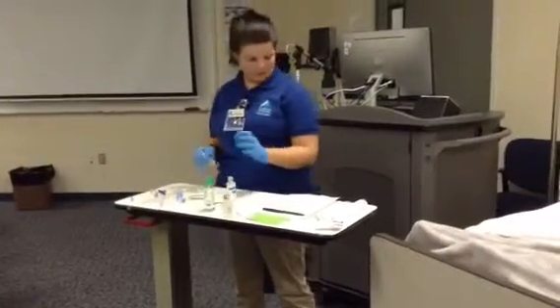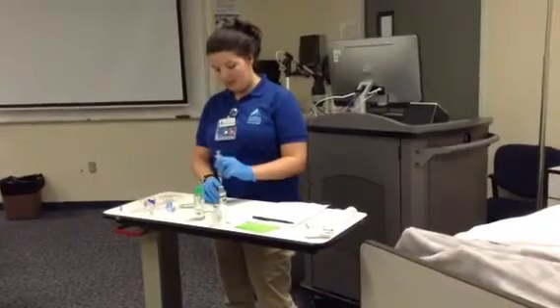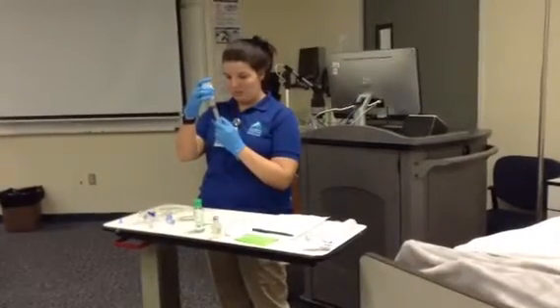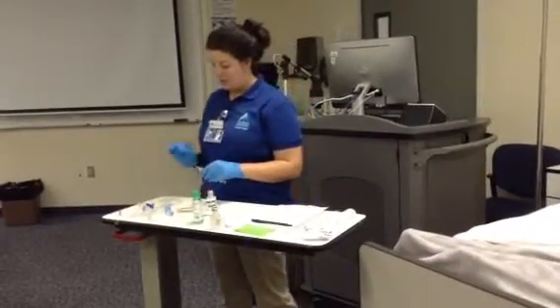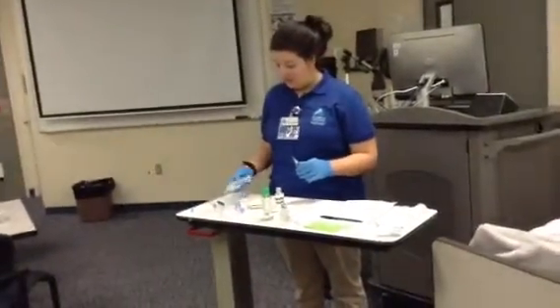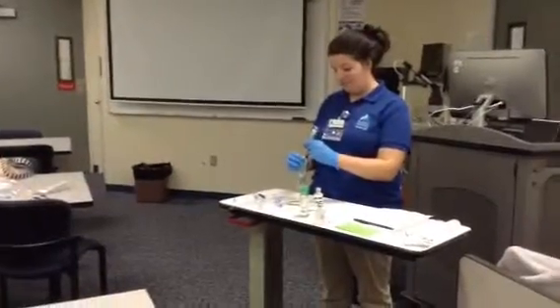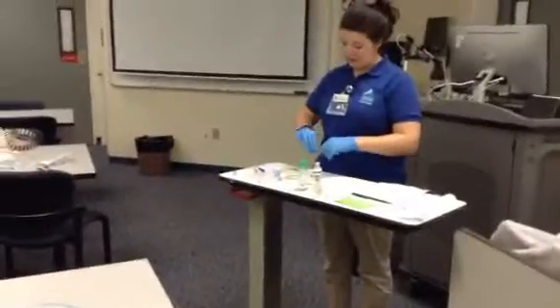Okay, do my 1 milliliter. Look at my MAR one more time. 1 milliliter. Vancomycin. Check that. Draw my 1 milliliter. Alrighty. That wouldn't go in the sharps just yet. I would go ahead, look at my bag, my medication, and stick my vancomycin, 1 milliliter in the bag, put this in sharps.